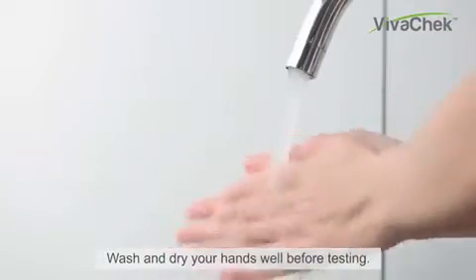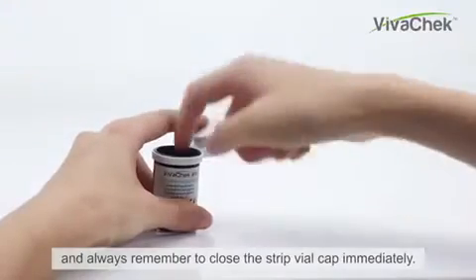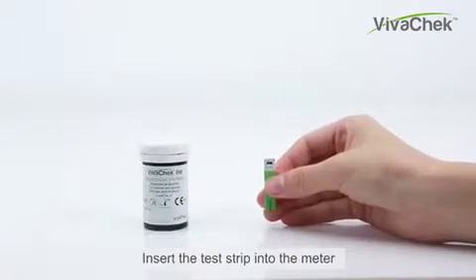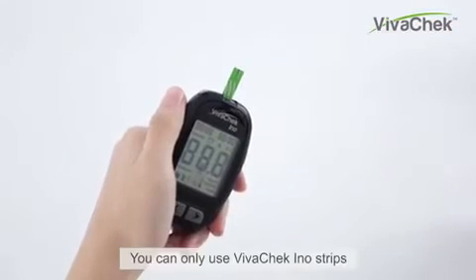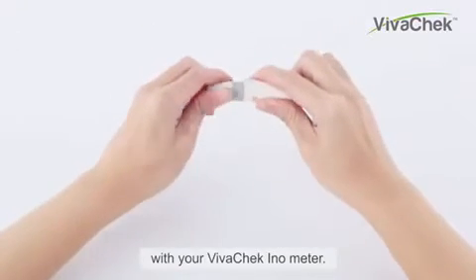Wash and dry your hands well before testing. Take a test strip from the Strip Vial and always remember to close the Strip Vial cap immediately. Insert the test strip into the meter in the direction of the arrows. The meter turns on after a bit. You can only use VivoCheck Inno strips with your VivoCheck Inno Meter.